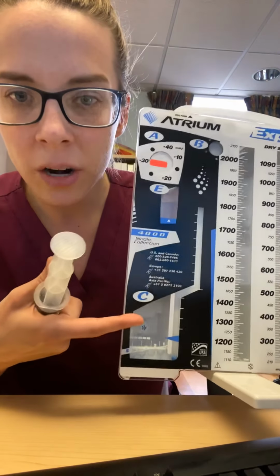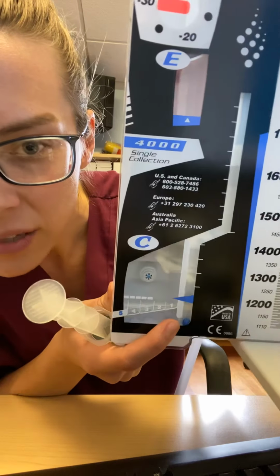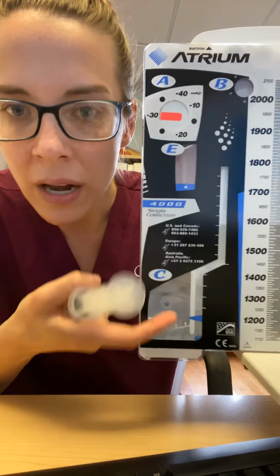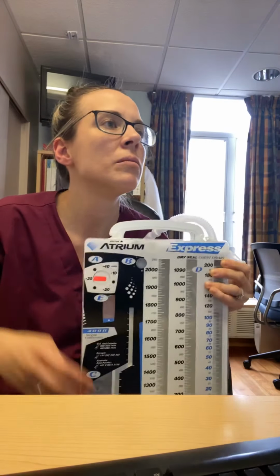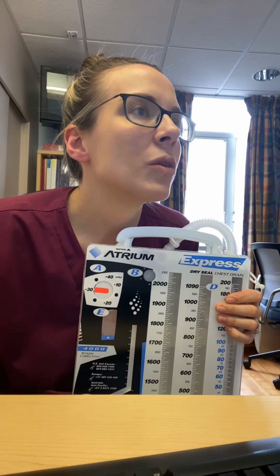So it makes the water blue. And there's a little blue ball in there that will float on top of the blue water. So if the patient has an air leak, this is where you will see the bubbling within this window. Again, that is where you will know if you have an air leak, bubbling in this window. Okay, bellows we talked about. Suction control regulator we talked about. Suction port we talked about.